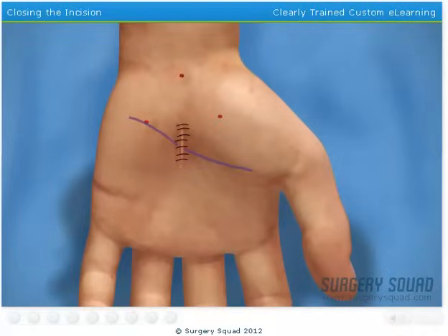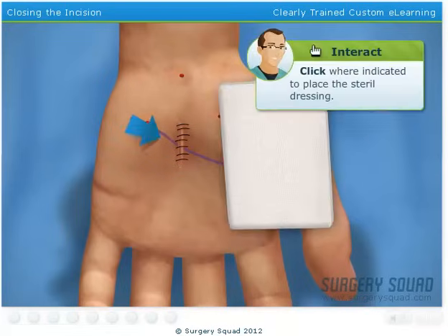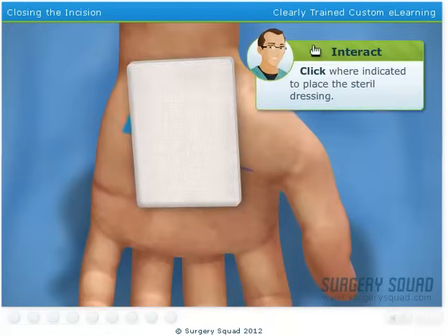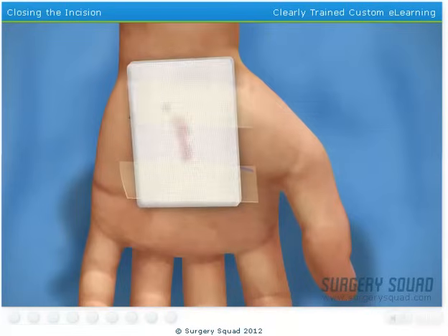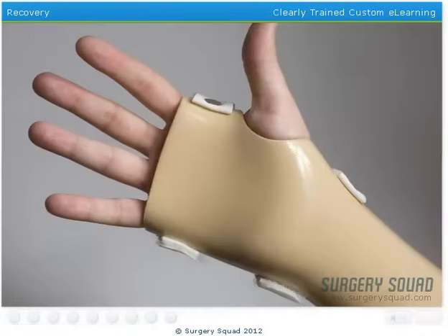And lastly, we'll place a small dressing over the wound to absorb any residual blood. We'll immobilize the wrist with a splint and a sling, and after one to three hours, our patient is sent home to recover.